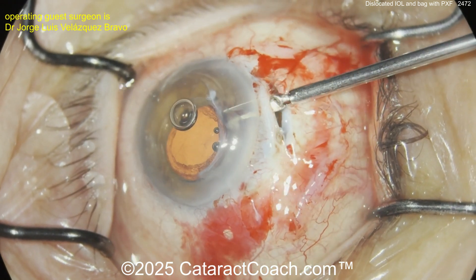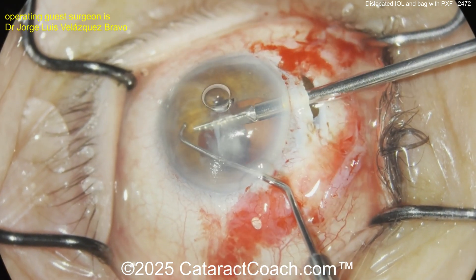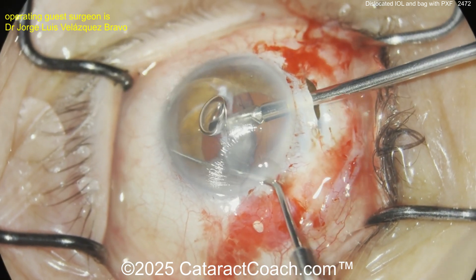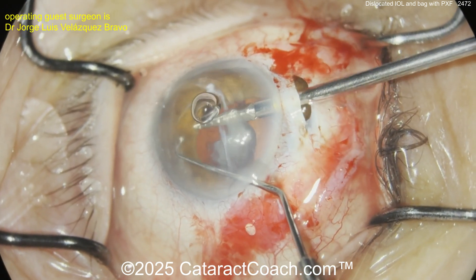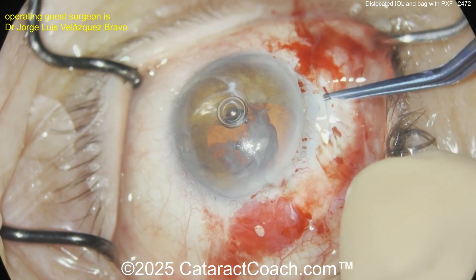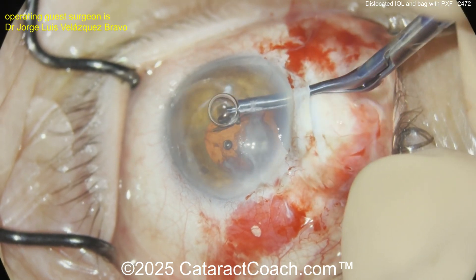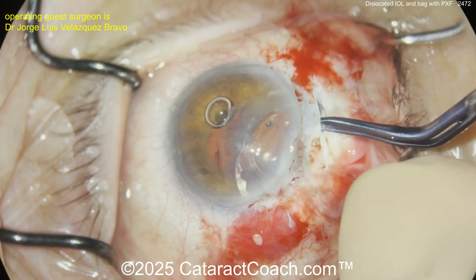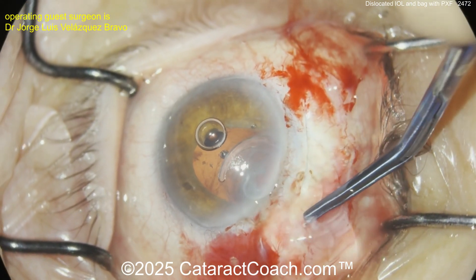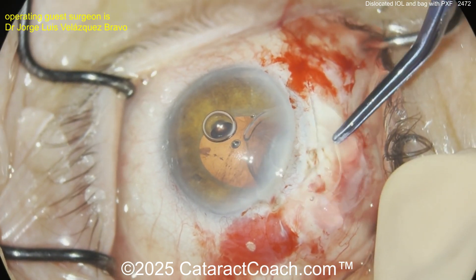Those look like scissors. There's a little bit of iris prolapse. They're cutting it in half — look at that — cutting through the bag and the IOL. I like the use of the chopper in the second hand to help fixate things. The lens was cut mostly through but not all the way, which makes it easier to remove part like this and then rotate it out. Keep them connected — I like that idea — cut down the middle but only about 80-90% of the way through, then rotating it out.